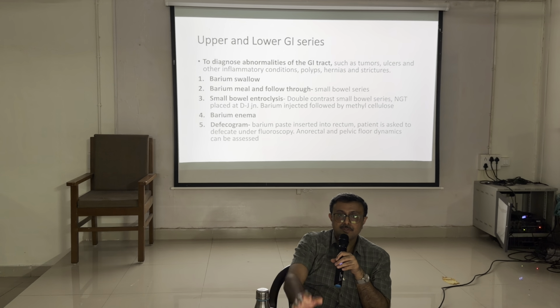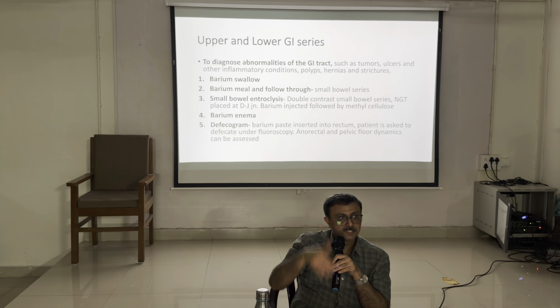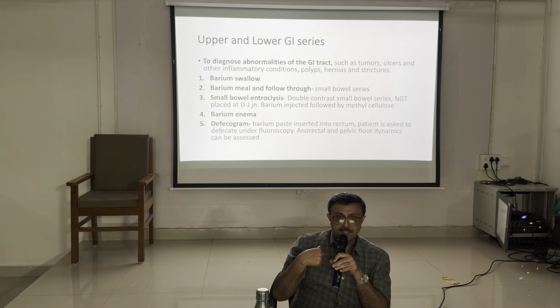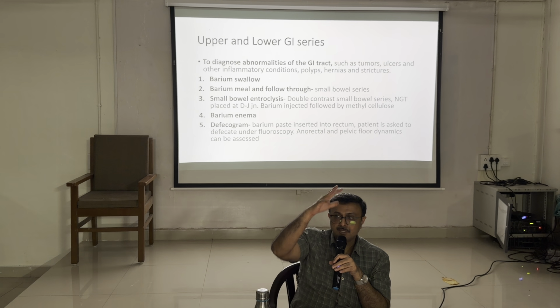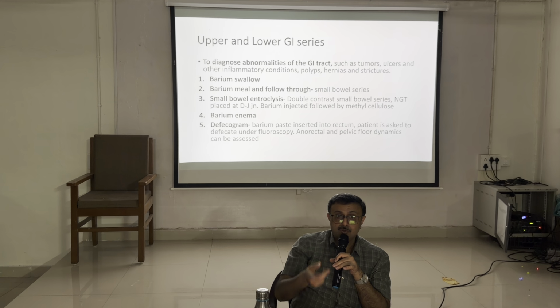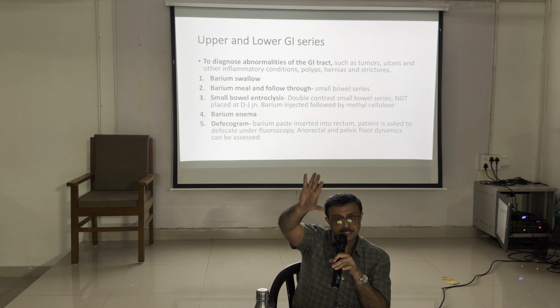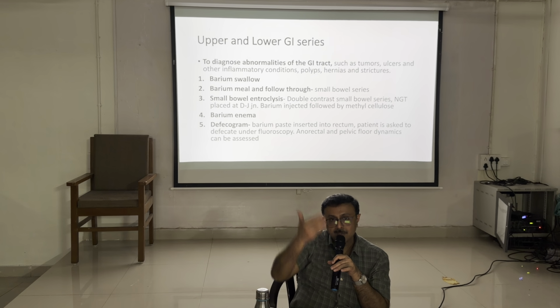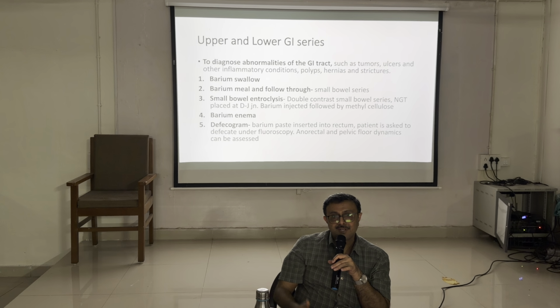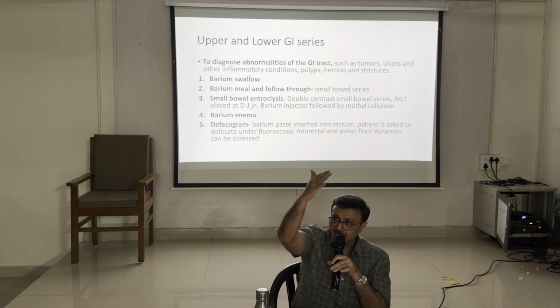So that is important. Barium is open, the patient has ingested barium. Now what will happen? We give effervescent fluid, ENO, which liberates carbon dioxide. Effervescent fluid, air is necessary. So now ingest ENO. It washes the luminal barium. Luminal barium will wash. Now what happens? It cannot wash the barium stuck to the mucosa. Barium is adherent like paste; it is pasted on the mucosa. It will not be removed by this effervescent fluid. Now what will happen? The mucosal lining will be visible. The lumen will clear, but the lining is visible.